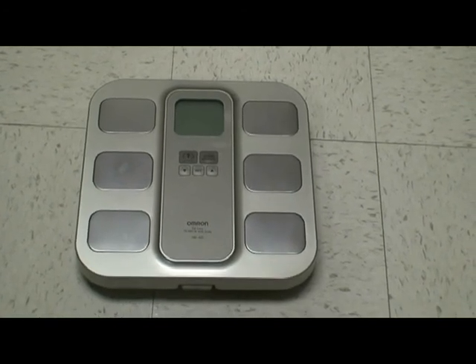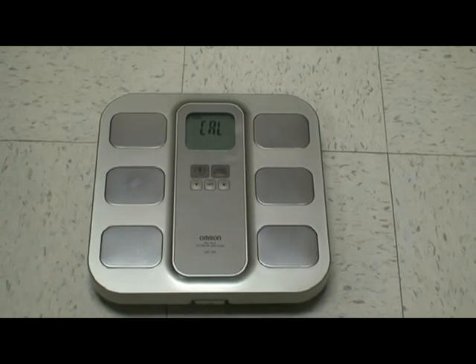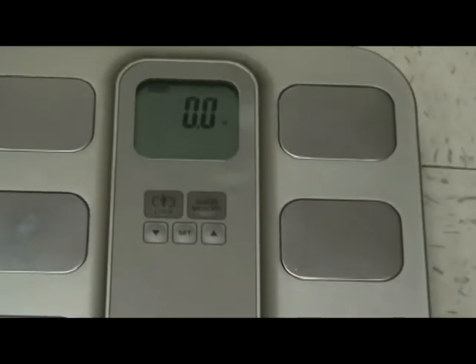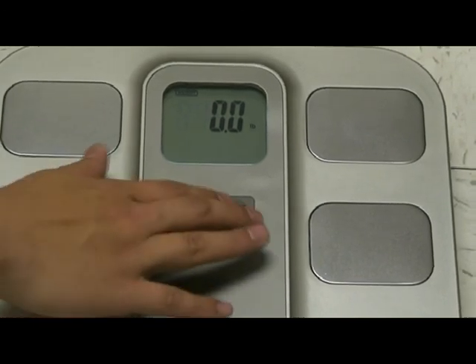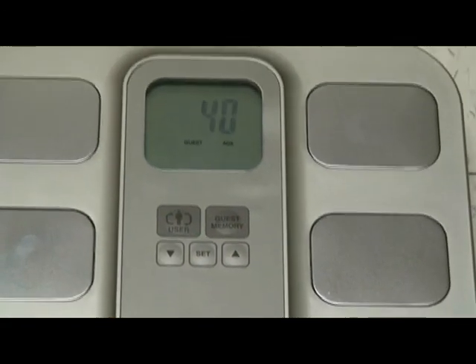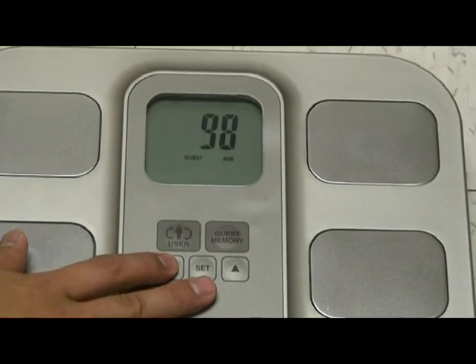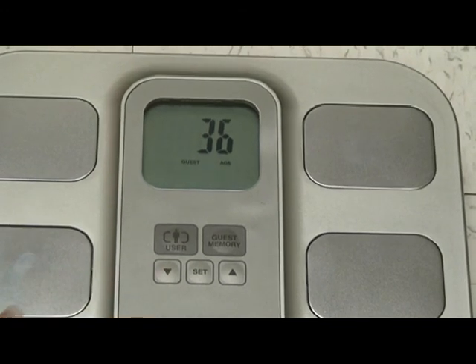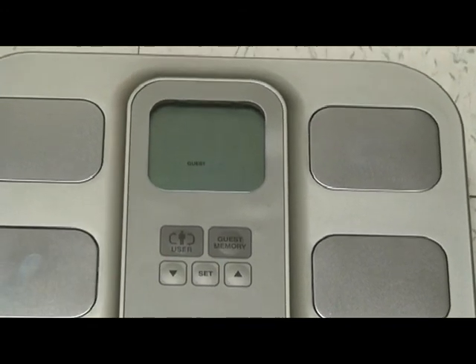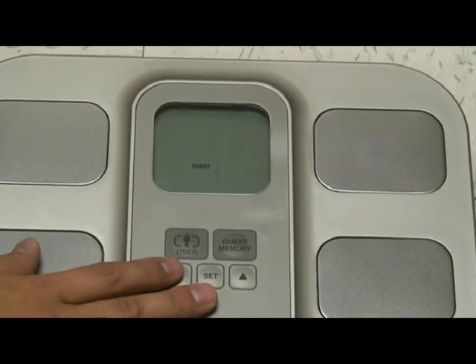First, you're going to turn it on the side. That turns it on. Then the next thing you're going to do is hit guest memory. And it asks you for the patient's age. You can use the arrows on both sides to put in the patient's age. When the age is determined, you're going to press set. It asks you if the patient is male or female. You're going to use the arrow again, and you're going to press set.